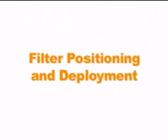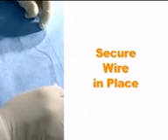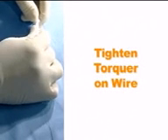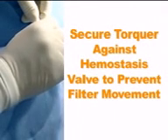Filter positioning and deployment. Use device markers to confirm device position in the predetermined landing zone. Secure the wire in place by advancing the torquer to the hemostasis valve. Tighten the torquer firmly on the wire. To deploy the filter, stabilize the wire by pressing the wire torquer against the hemostasis valve, and then pull back on the EZ delivery sheath until the filter loop is deployed.